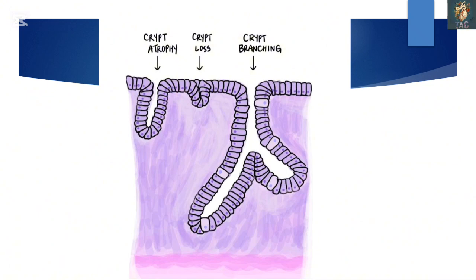Before proceeding towards our first slide, that is of chronic ulcerative colitis, I have to show you some histological features diagrammatically on the preceding slides. So just have a look. Ulcerative colitis is characterized by a diffuse and continuous inflammatory process limited to mucosa and submucosa of colon.